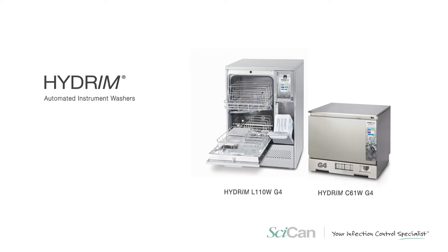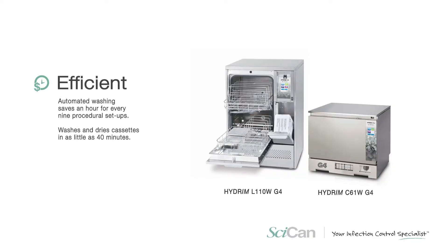What we have is the Hydrum instrument washer, which does a better job of cleaning instruments than hand scrubbing or an ultrasonic. By using the Hydrum, every single instrument gets treated exactly the same way every single time, and we get a very high quality cleaning.